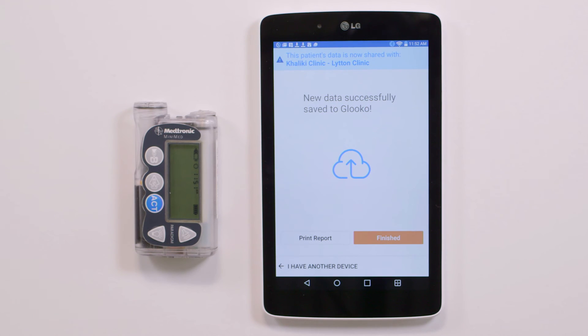Awesome! You've learned how to sync Medtronic data for a patient who is new to Gluco Kiosk and has an existing CareLink personal account.